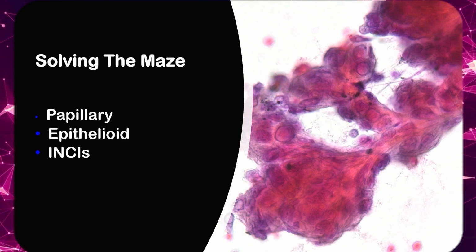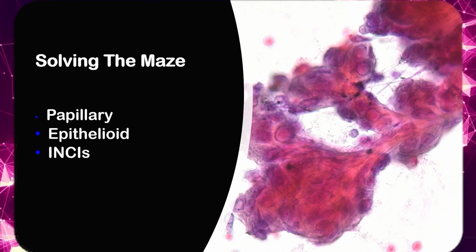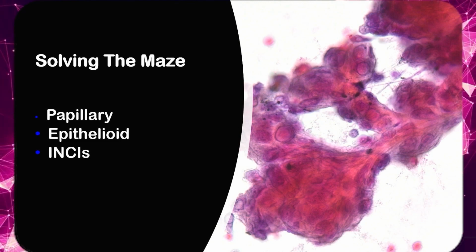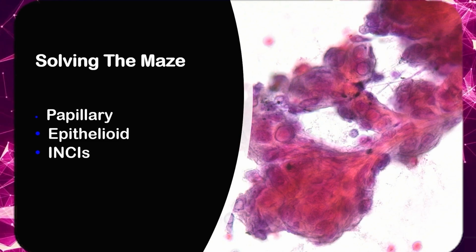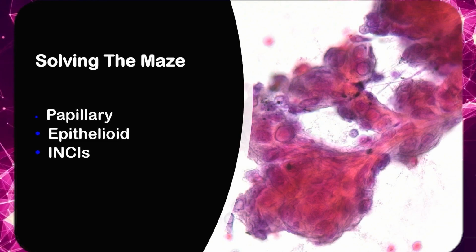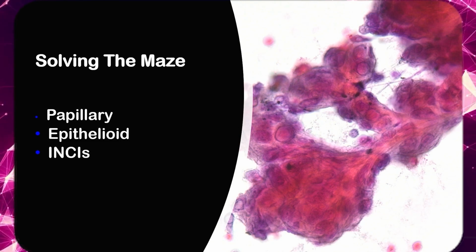Absolutely. Blame the patient now. I'm sorry? So which stains would you like to do? Negative. Negative. Negative.